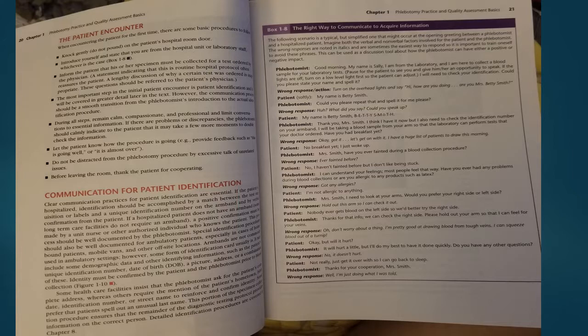The most important step in the initial patient encounter is patient identification, and it will be covered in greater detail later in the text. However, the communication process should be a smooth transition from the phlebotomist's introduction to the actual identification procedure. During all steps, remain calm, compassionate, and professional, and limit conversations to essential information. If there are problems or discrepancies, the phlebotomist should calmly indicate to the patient that it may take a few more moments to double-check the information.